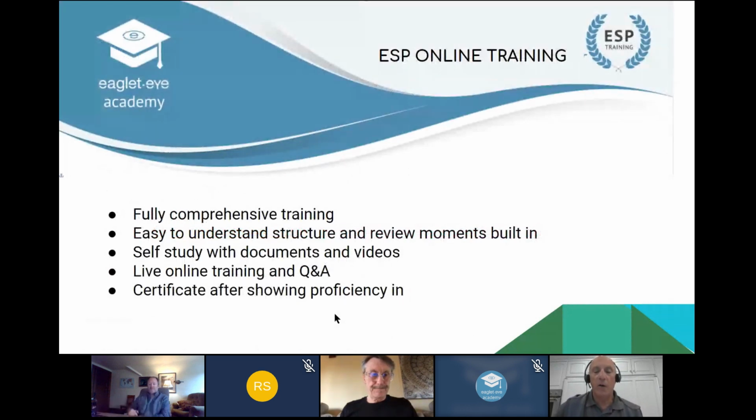I don't know when Christine thinks they're going to come out with that, but she's just validating data now, which we're working on. Hopefully it won't be too long. We're getting pretty close.